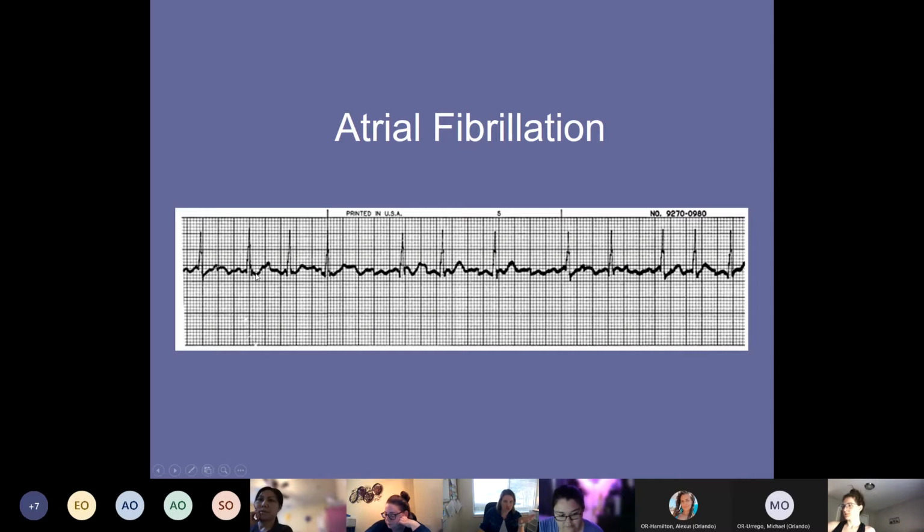The difference between atrial fib and SVT is atrial fib is irregular. Okay, these are not coming from the P wave at all. These are coming from multiple irritated atrial ectopic foci. Ooh, that's a mouthful, right? So when I talk about ectopic, kind of like when we think about ectopic pregnancy, coming from another area than what was intended. So if we've got an ectopic focus in the atria, that means it's a cell other than the SA node.